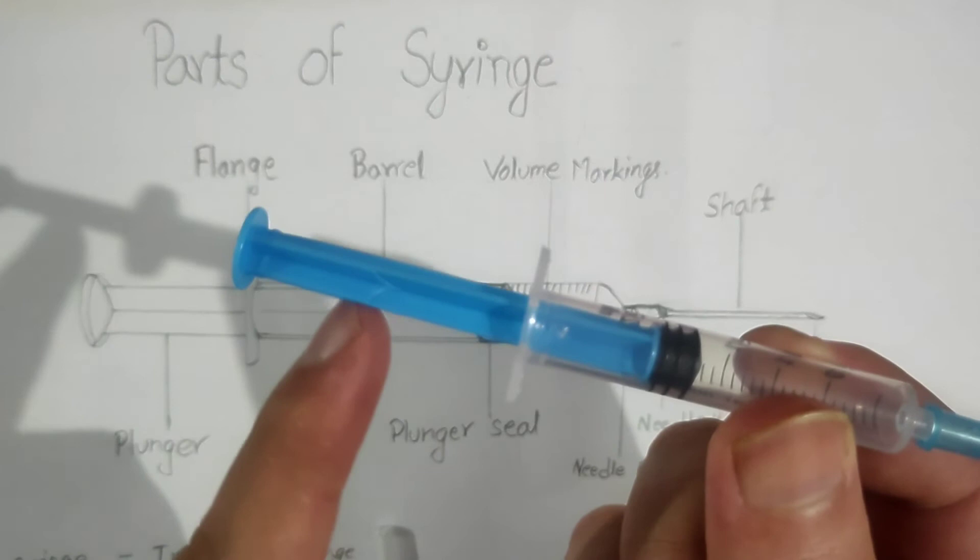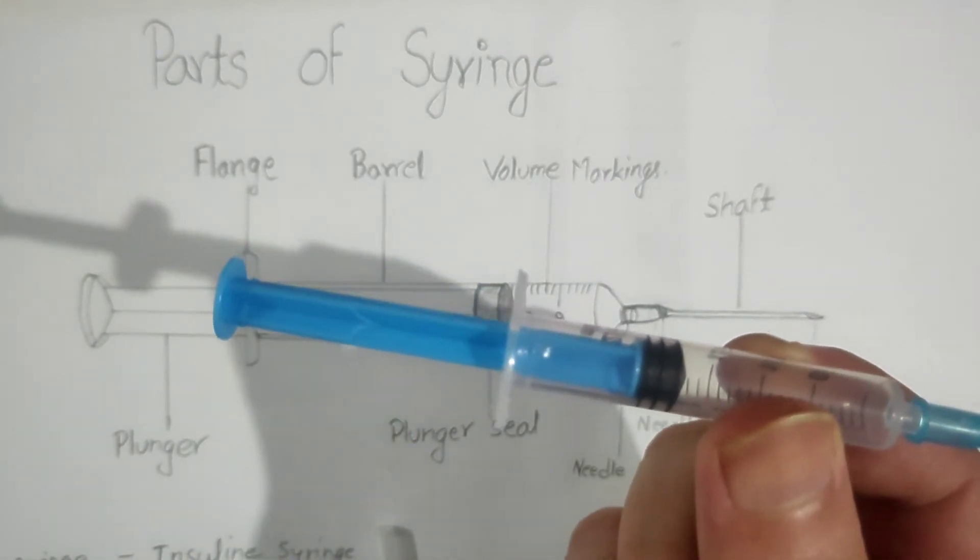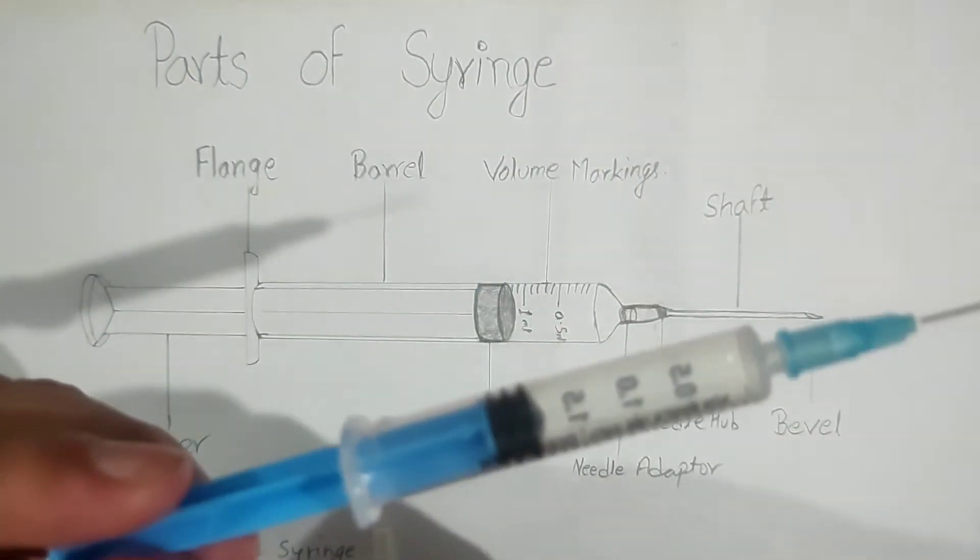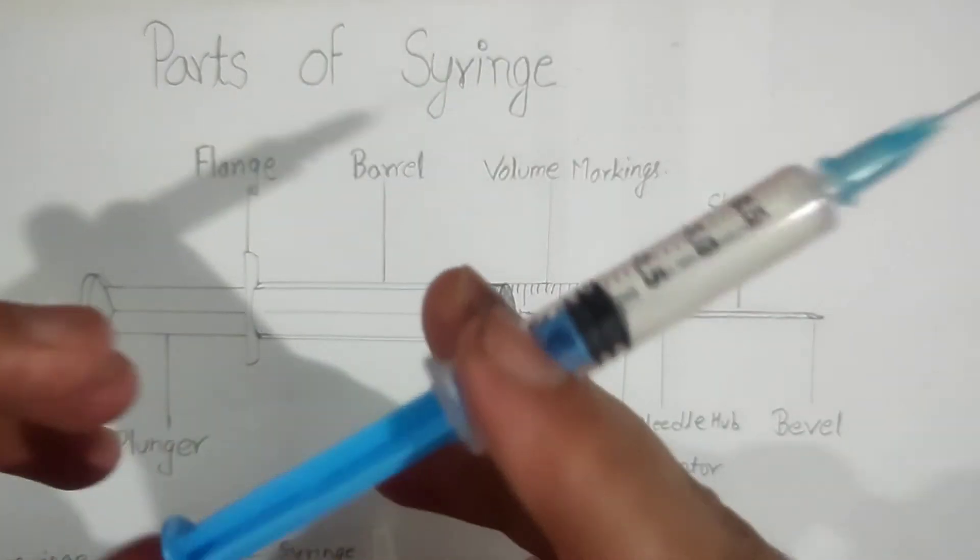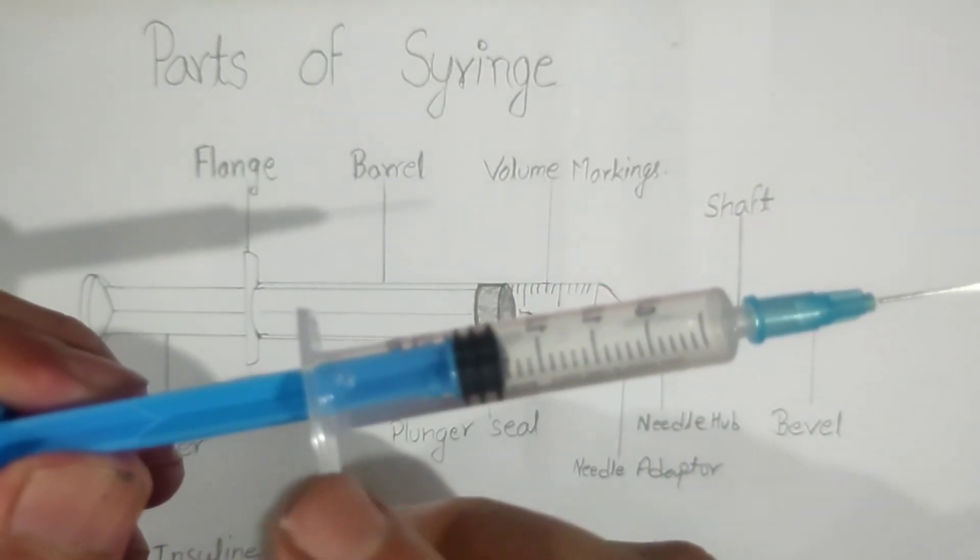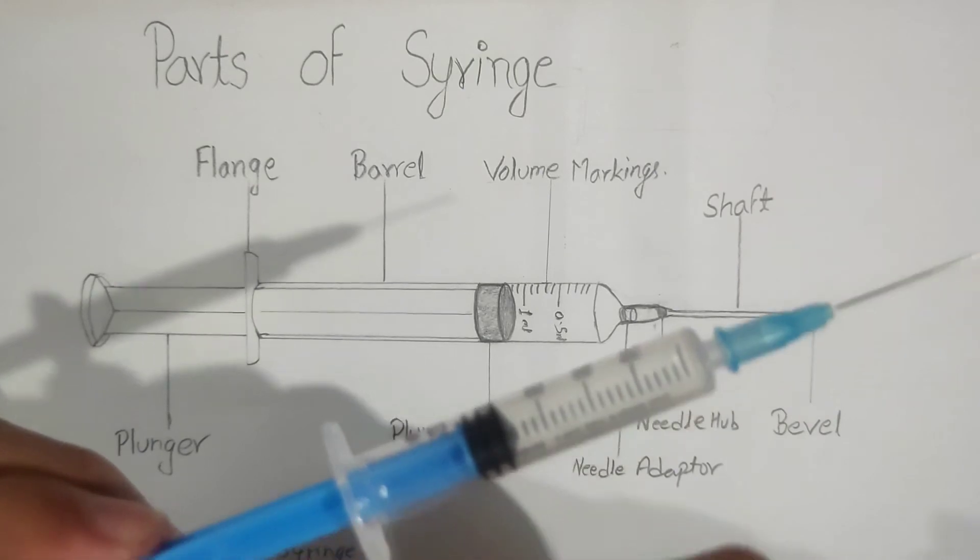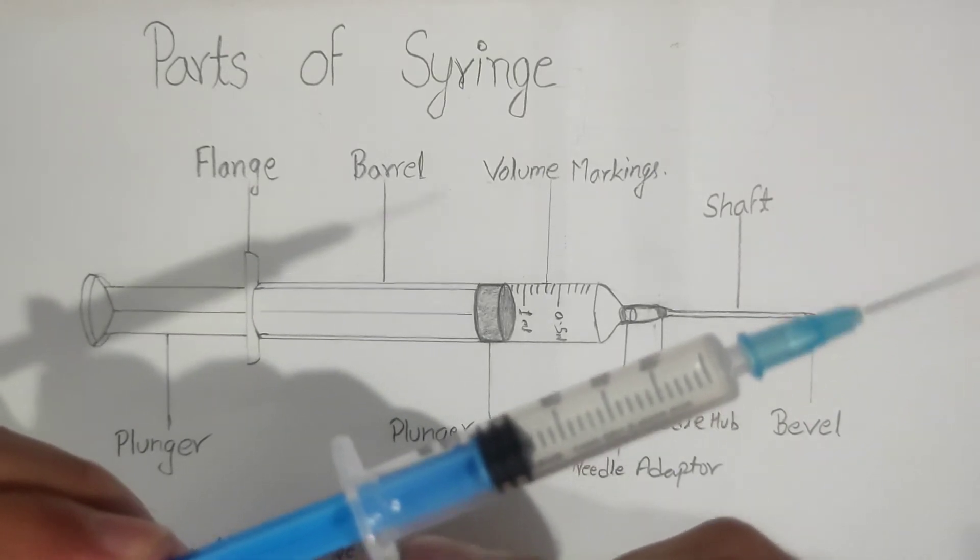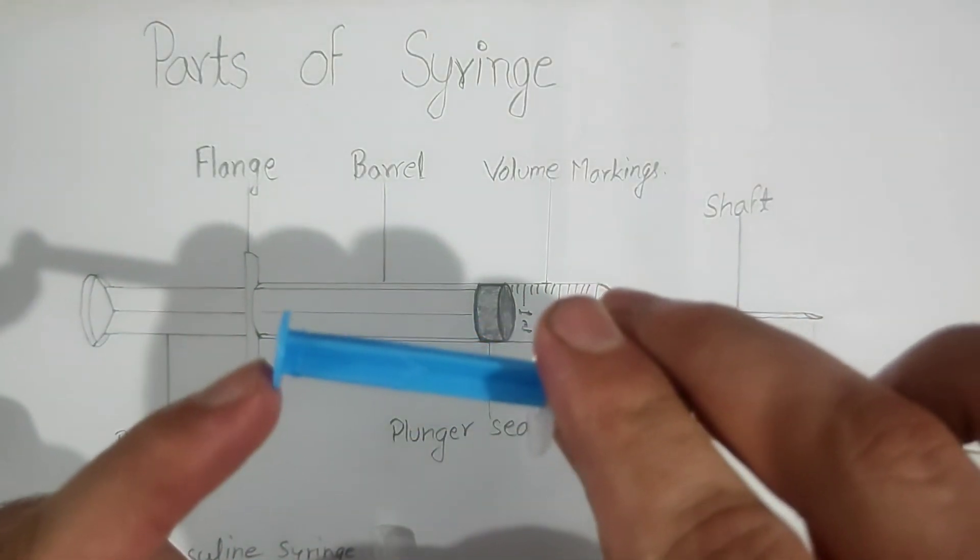This portion is known as the plunger, and this part which is used to hold it is known as the barrel flange. It is attached with the barrel, so it is known as the barrel flange.